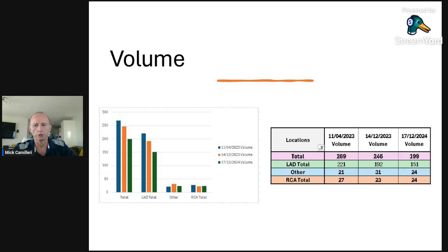The best that you're told you can hope for is a stabilization and not getting any worse, but don't expect reduction. Even if these tests were a little bit out in terms of the quality of the image or those sorts of things, they are still showing a significant regression.